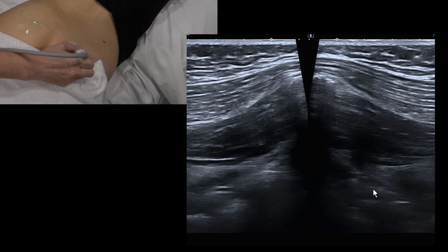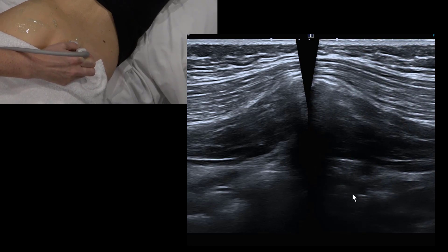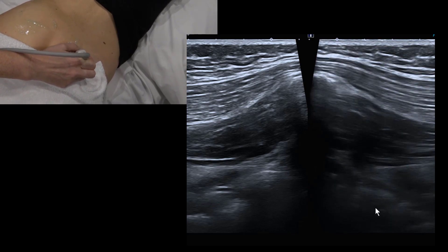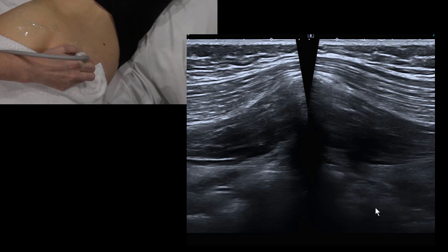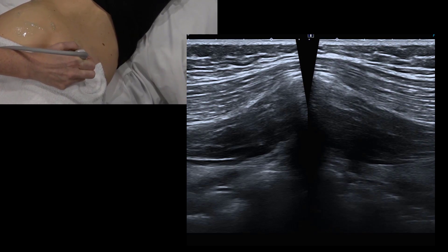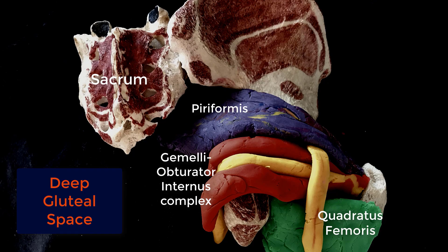You can actually see the peritoneum — the bright white line — which is inside the abdomen, and then bowel peristalsis below that. In this region we're looking for hypertrophy, denervation, and atrophy of the piriformis.